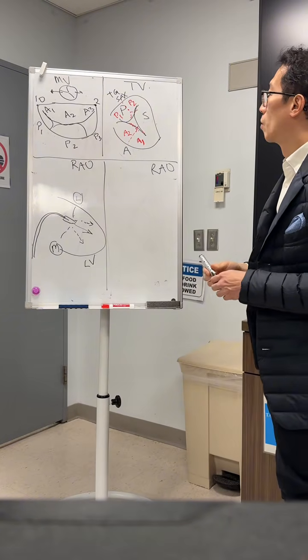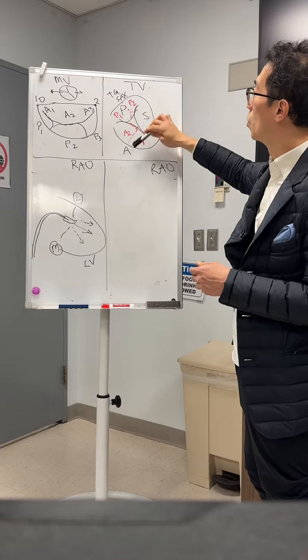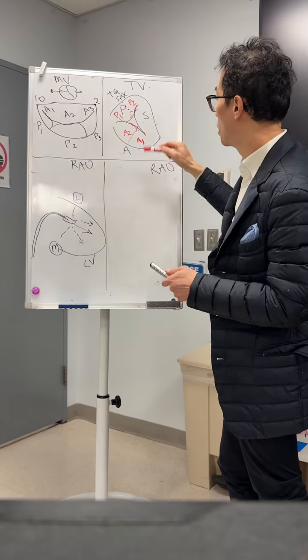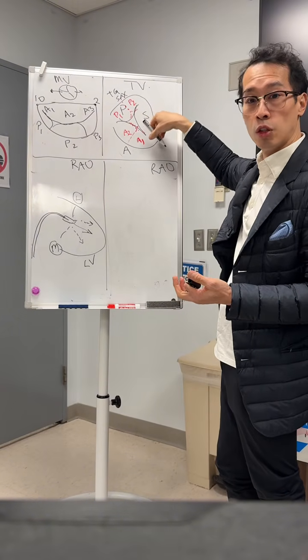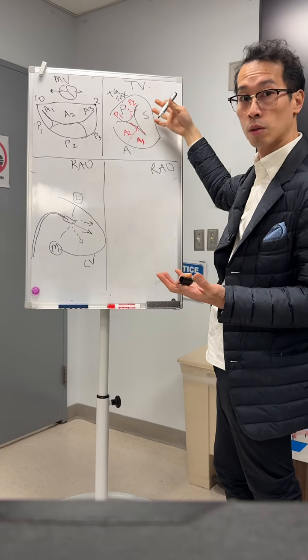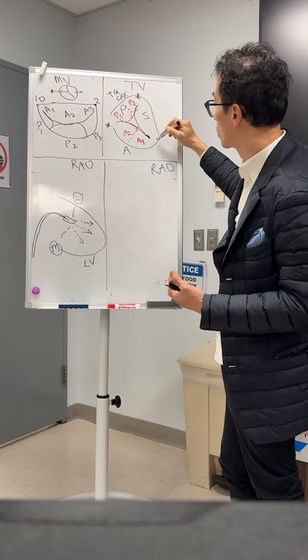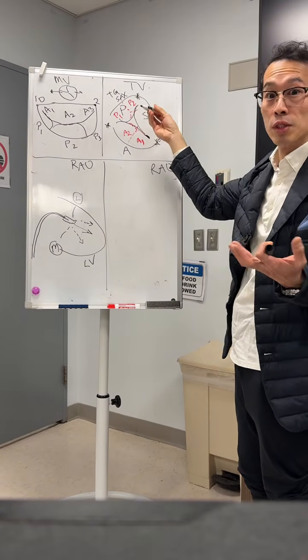So again, when we look at here, it's very important to have the imager give you the orientation of this. And this is also the same for replacement as well. You want to be able to figure out where these commissures are, because let's say for replacement, if you have an anchor here, you know that you're not going to have leaflet insertion on the grasping view, or to look for engagement. So you need to understand where this is, so that you know that you're not going to get grasping on this plane because there are no leaflets to grasp.